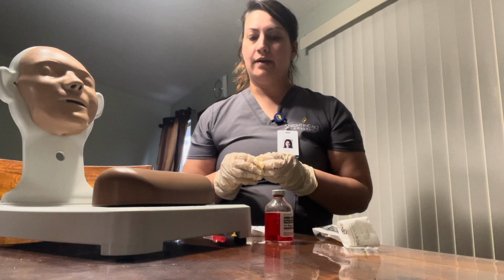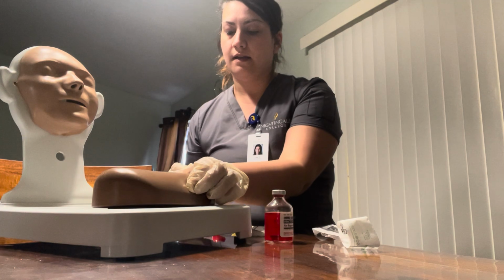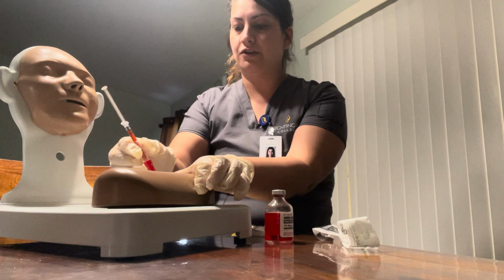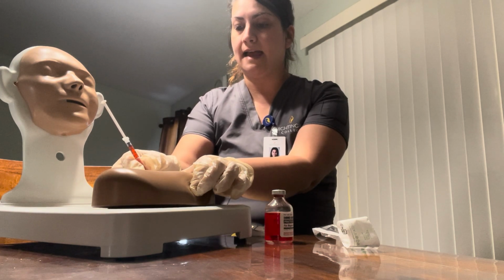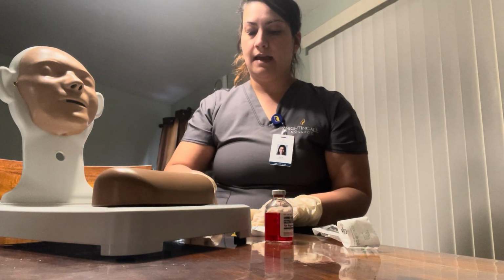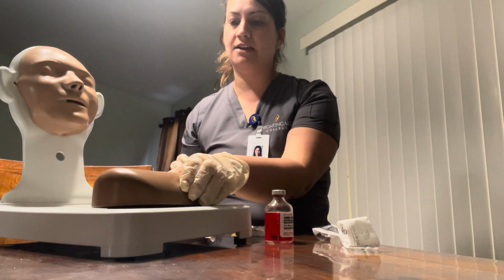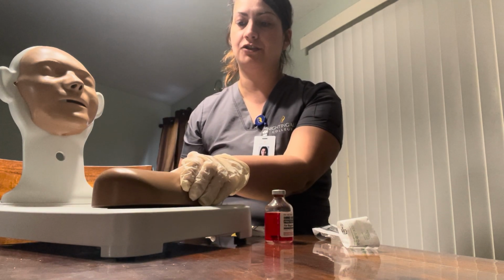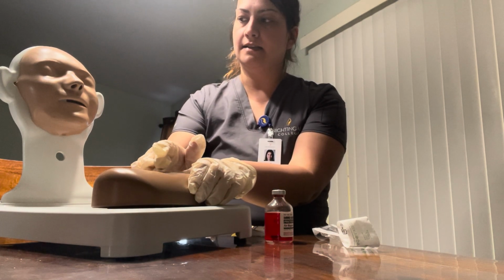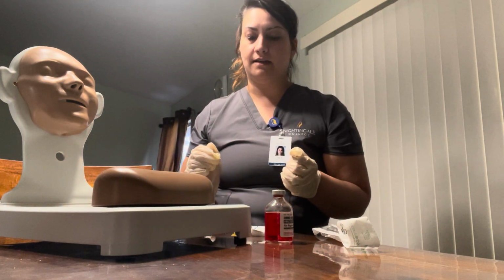I will grab the skin and make sure that the needle is 1/2 inch in, which it is. And we will assess for any inflammation, any edema, any infection. We will palpate for tenderness or masses. Any tenderness here? No? Okay. So this is the site that we're going to be injecting.